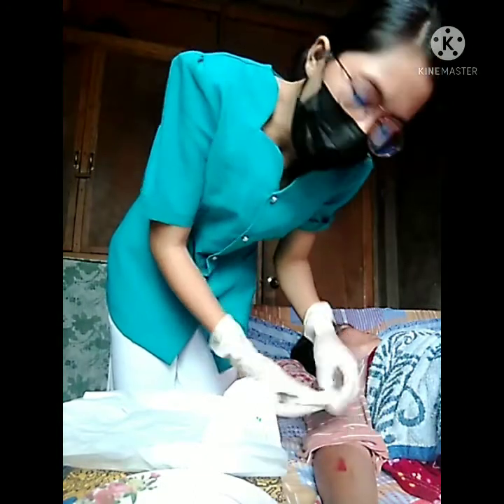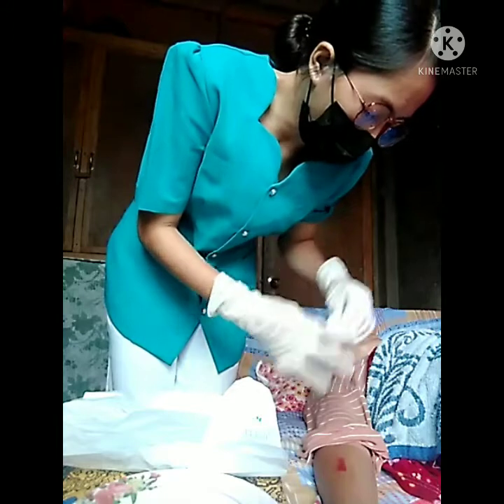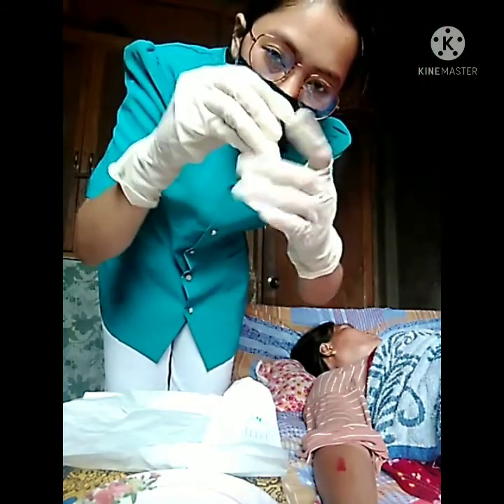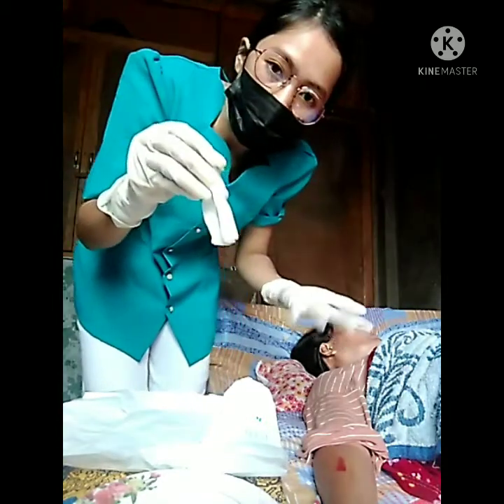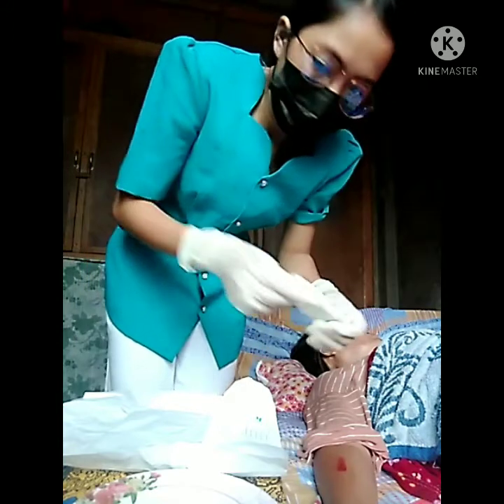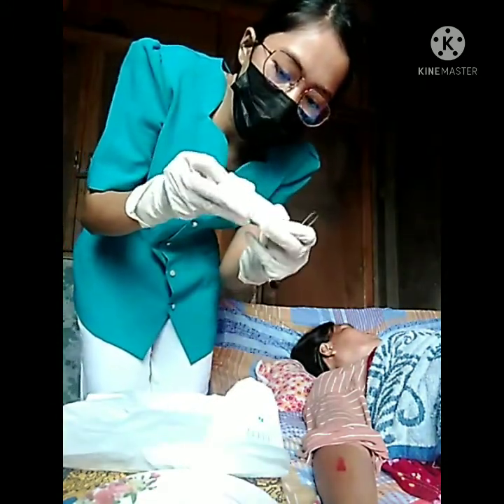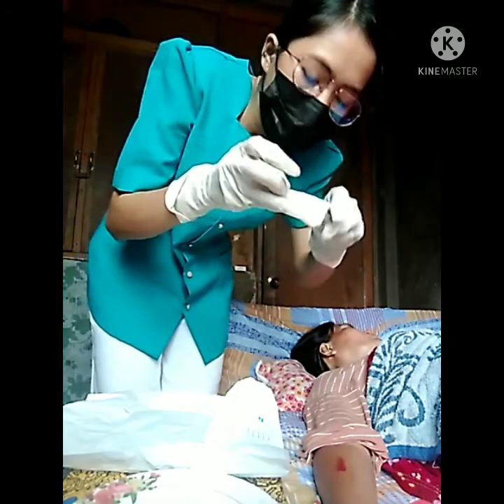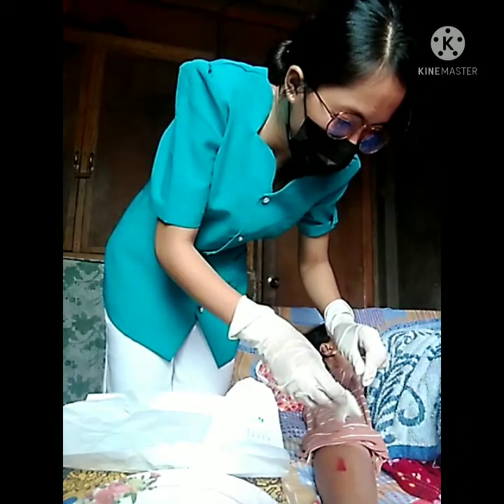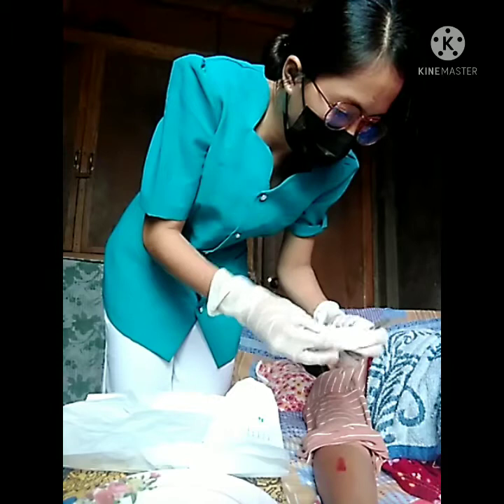And then if the wound is deep, gently pack it into the wound with forceps until all wound surfaces are in contact with the moist gauze.